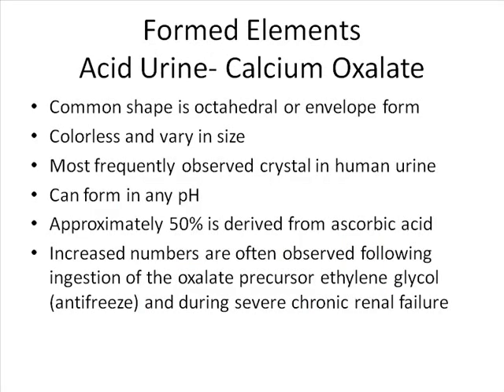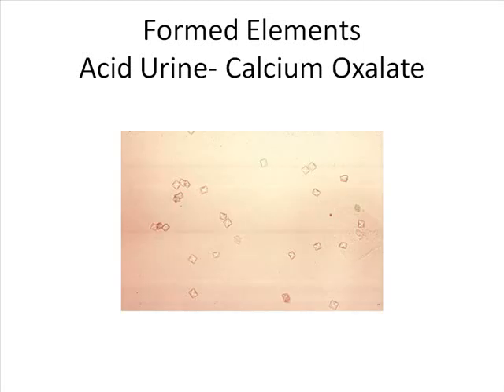Uric acid is totally normal. It is a normal crystal unless you're seeing a lot of it in totally fresh urine, and that fresh urine also has RBCs. Okay, because that can mean renal calculi for any crystal, really. All right. Calcium oxalate, another totally normal crystal. We see calcium oxalate basically in its cross form normally.